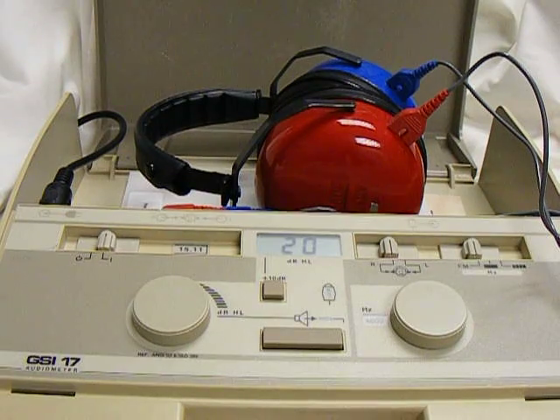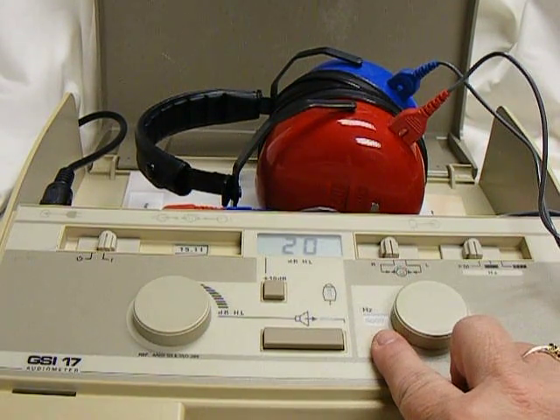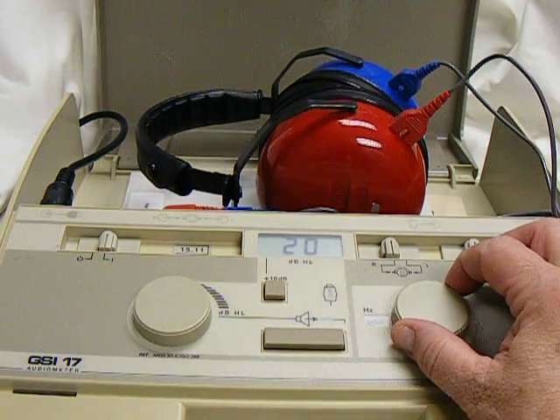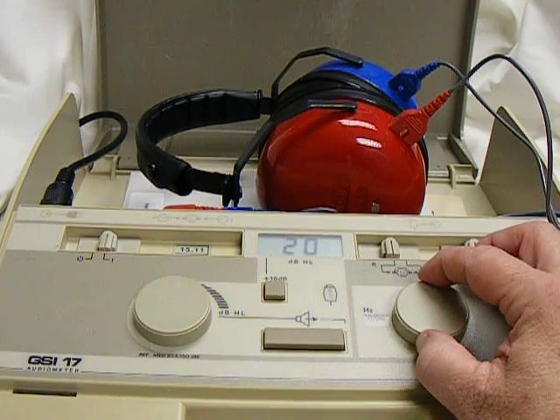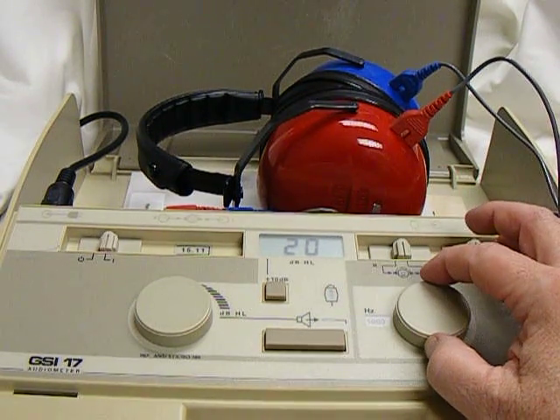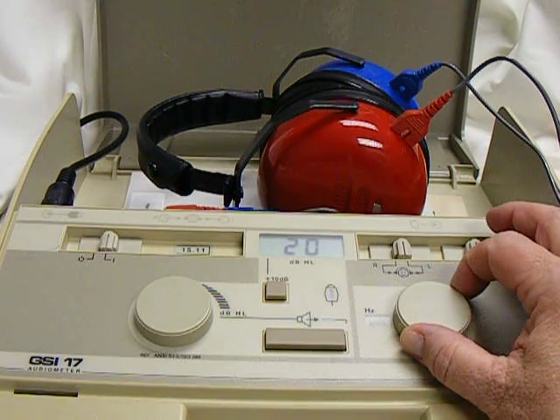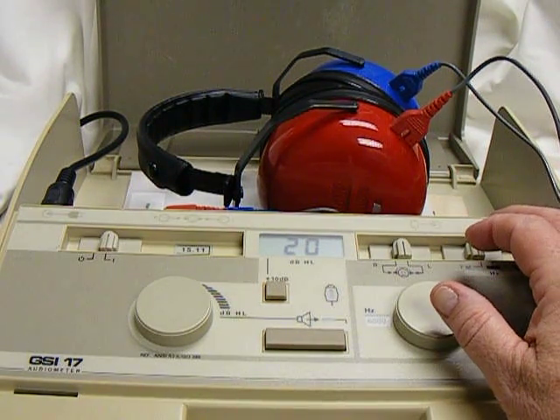If your student is in high school or middle school, you would want to start at 6,000 — do 6,000, 4,000, 2,000, 1,000. Switch ears, then 1,000, 2,000, 4,000, and 6,000.